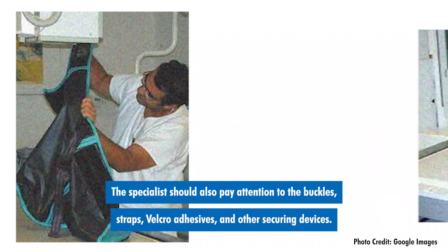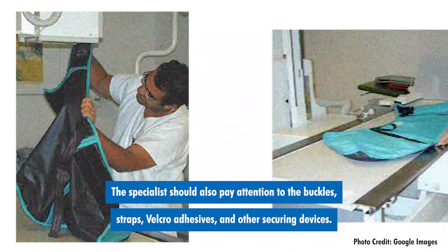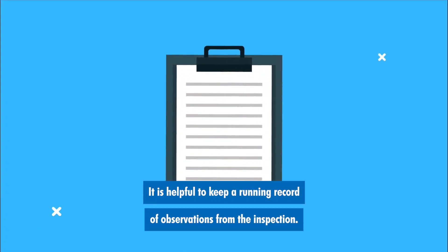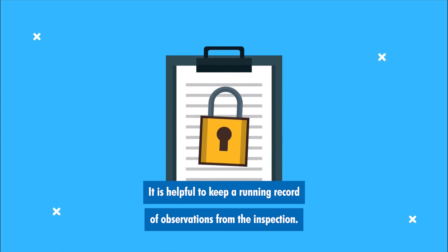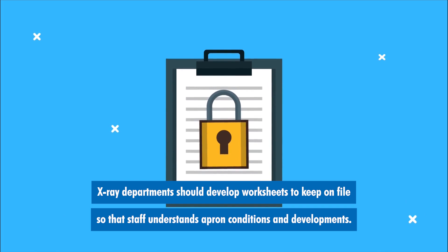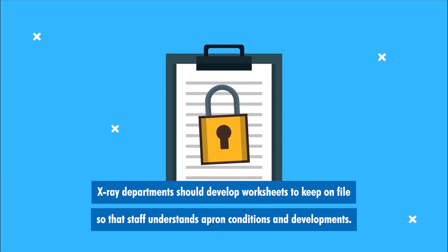The specialist should also pay attention to the buckles, straps, velcro adhesives, and other securing devices. It is helpful to keep a running record of observations from the inspection. X-ray departments should develop worksheets to keep on file so that staff understands apron conditions and developments.